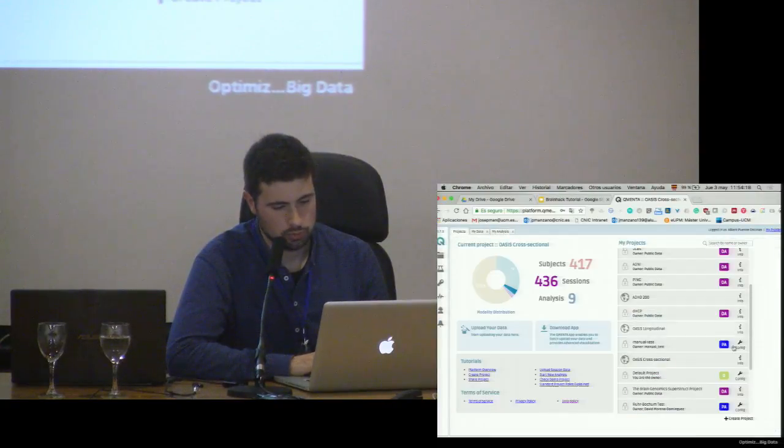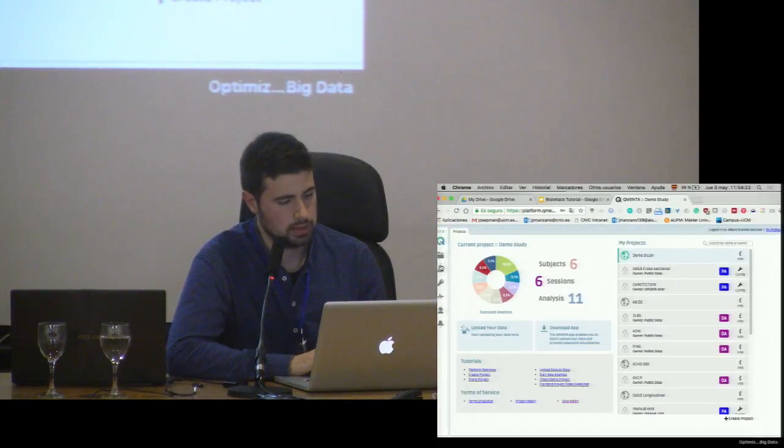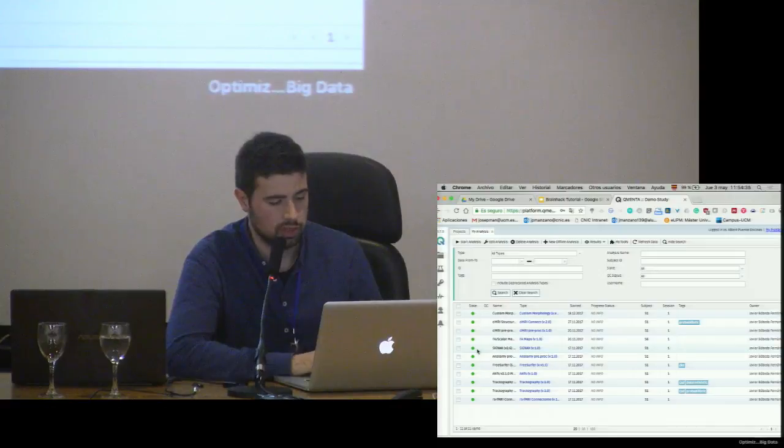If I go now, let's go back to the demo study. You can see here the analyses that have been run on this study. And these analyses typically compute two things. One is a report, and then the list of all output files for this analysis.